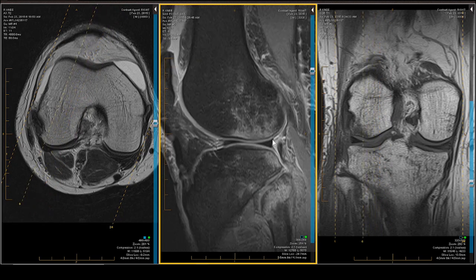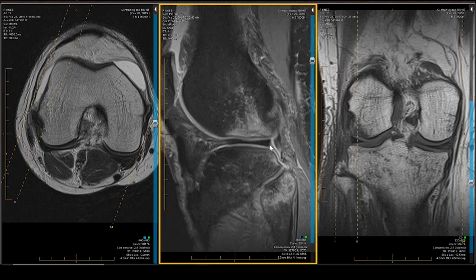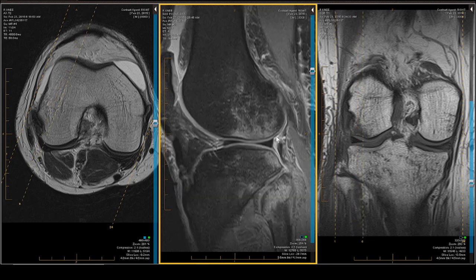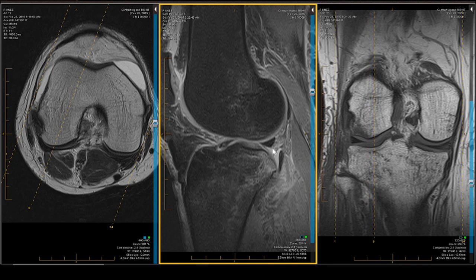The posterolateral meniscus has an upper attachment and a lower attachment, which forms its hiatus. These attachments go from superficial to deep. Here's the lower attachment, a nice triangle, here's the upper attachment, another fascicle. The attachments are still present until we get in deep, where the meniscus appears to float — the inferior attachment of the lateral meniscus has come undone from the fractured posterolateral tibia. This is usually not problematic and will typically heal.